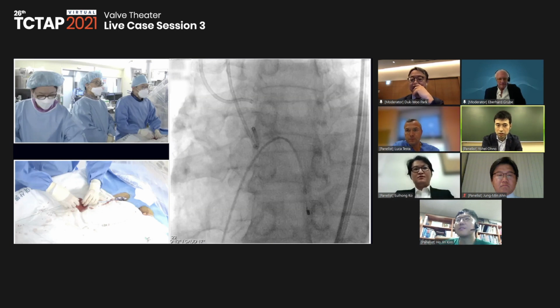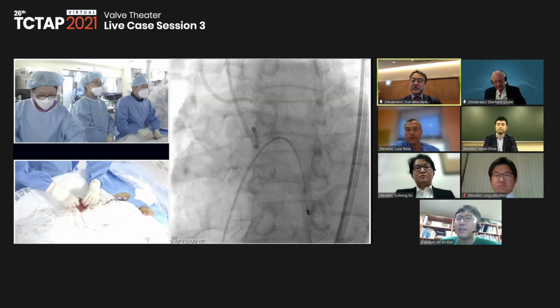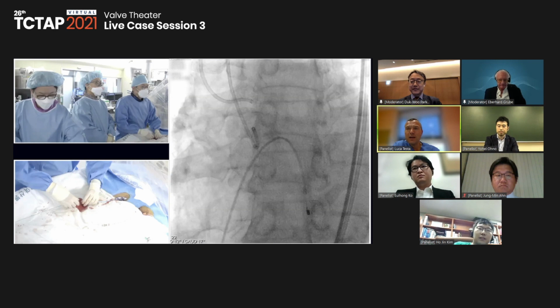Thank you so much. We can also combine CT with low contrast. And as Luca mentioned, we take the information of calcification together with MR angio without any contrast. Great. But I think that the MRI is really cumbersome sometimes. They are older patients, and the acquisition of the MRI sometimes takes a lot of time.